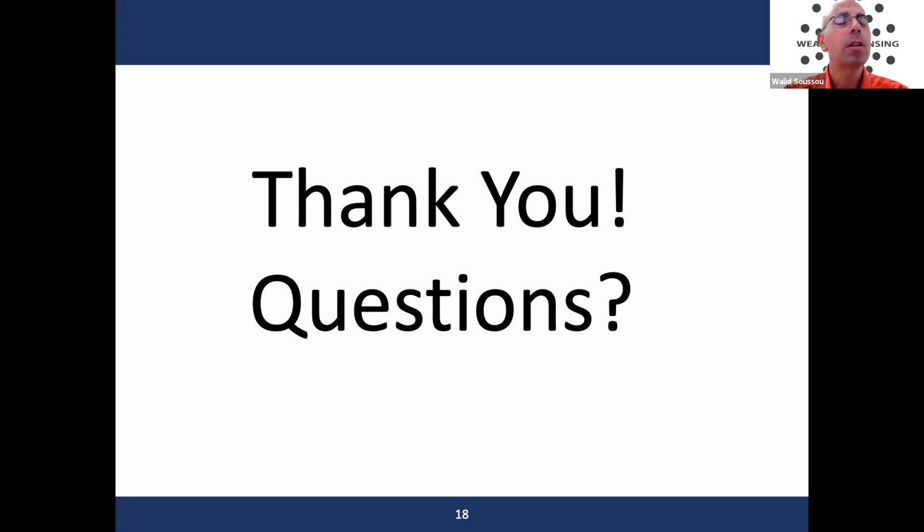I'm going to share a little bit of information from what we do with fNIRS in relation to that question. I think this person might have been asking about the use of fNIRS as a parallel measure to demonstrate focus and attention while you're doing the task. We have recently developed an EEG plus fNIRS device, and we had a webinar about that. If you're watching this on YouTube, you can click through the other webinars and see the fNIRS and EEG. You can measure EEG and fNIRS at the same time, so you can apply some of the analysis that Murat is describing, and also do the fNIRS in parallel to look at mental workload.